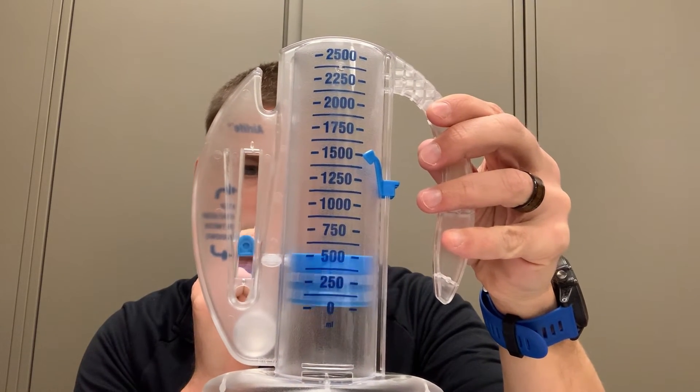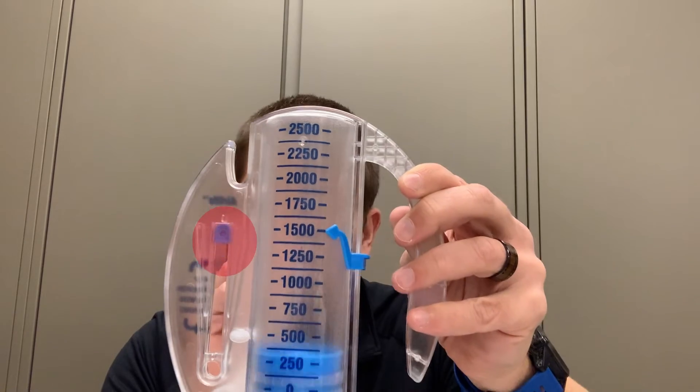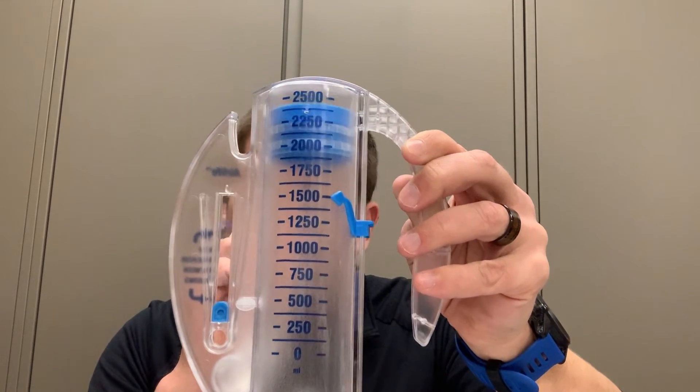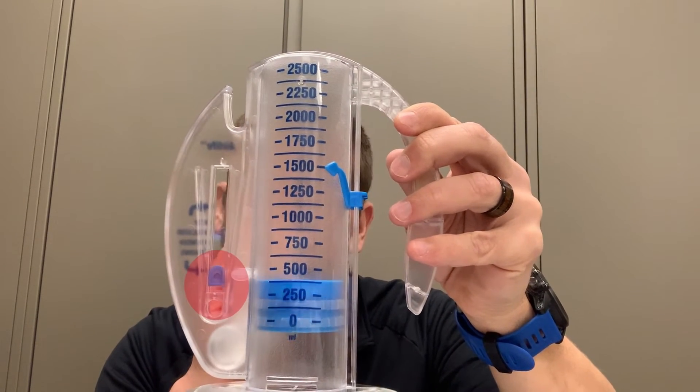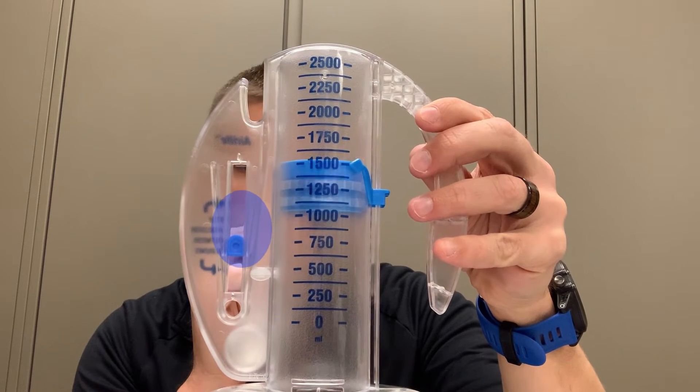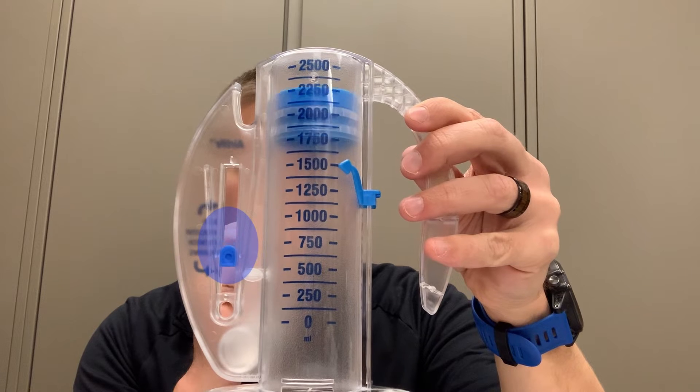This is to help the patient maintain a slow inspiration. When the patient inhales through the spirometer, the blue tab will begin to float. If the patient takes a fast, deep breath, the tab will float above the indicating arrows. And if the patient breathes too slowly, the indicator won't reach the arrow. A slow, consistent inhale will keep the tab floating steadily between the two arrows.